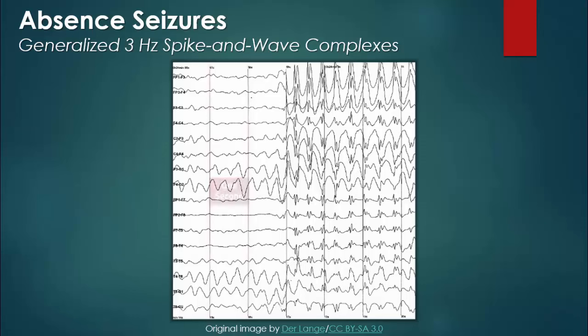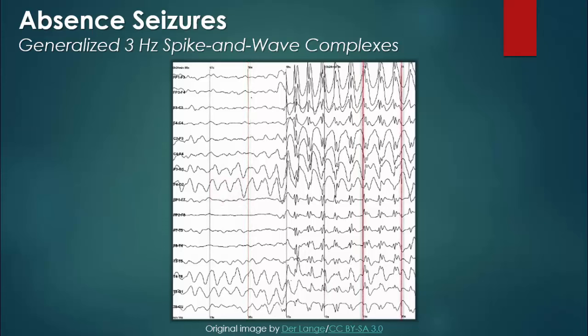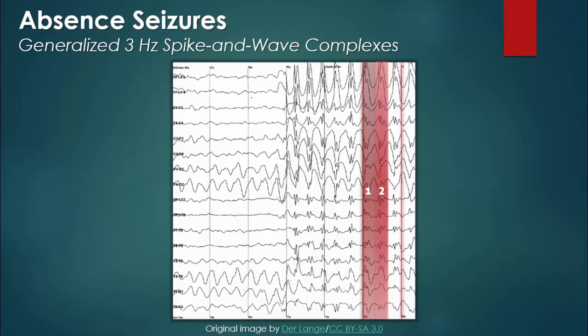Lastly, we need to determine the frequency of the complexes. As you may be aware, the vertical bars are separated by a duration of one second. Counting the number of spike-wave complexes that occur between the two bars, we find that approximately three occur per second.